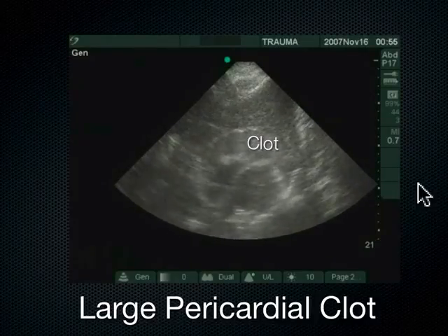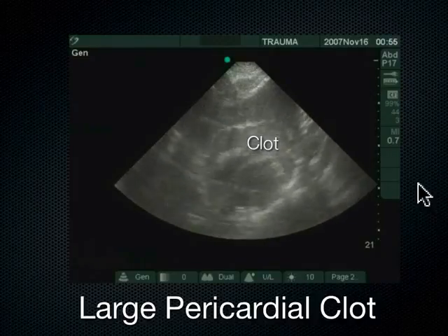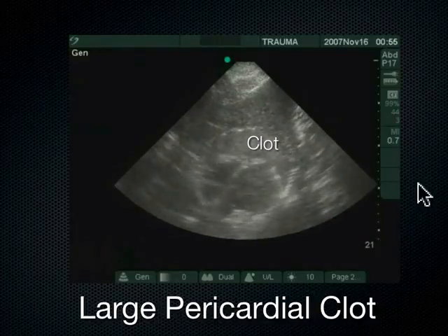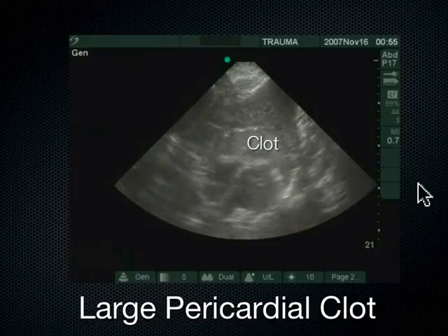The next question is, would you inject any heparin into that pericardium once you were in there, or any urokinase or anything to that pericardial area? Wouldn't work fast enough. Okay. The patient's dead in 3 minutes. Should you wash it with saline and try to break it up with something? I don't know. People always ask me these questions. I never know the answer to it.